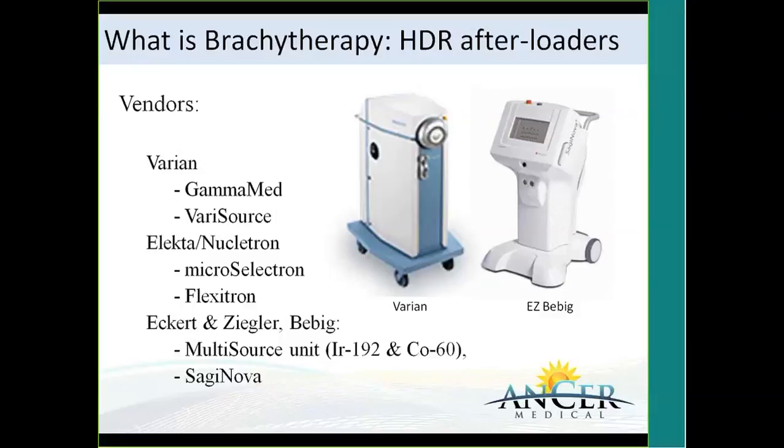So they have 5 or 6 sources a year instead of 3 or 4 sources a year. It all depends on how many patients you have and how quickly you want the treatments to be. Remember, if the activity of the source is very low, your dose rate will be that much lower as well, and so it will take that much longer to deliver the same dose compared to a new source. I see.